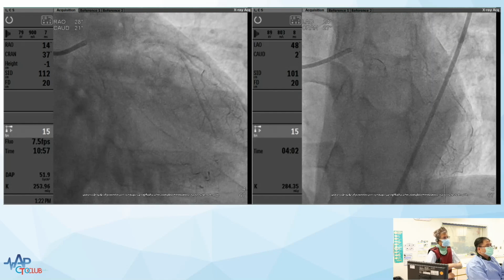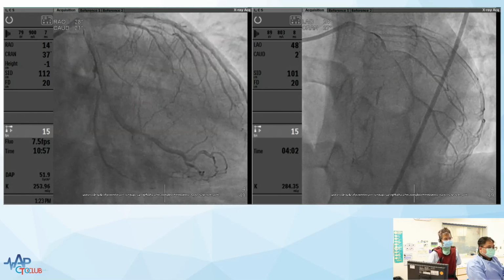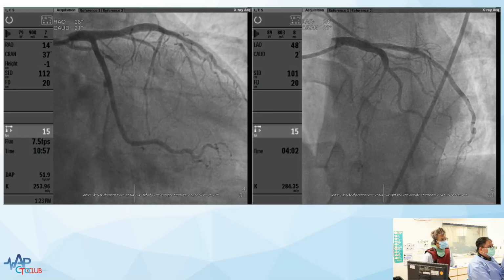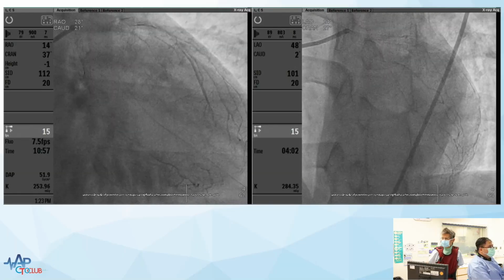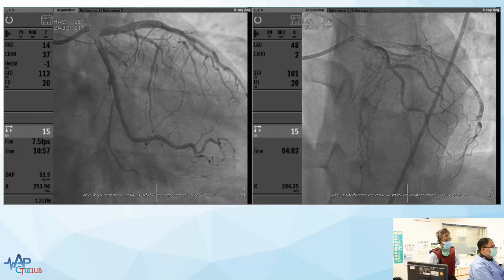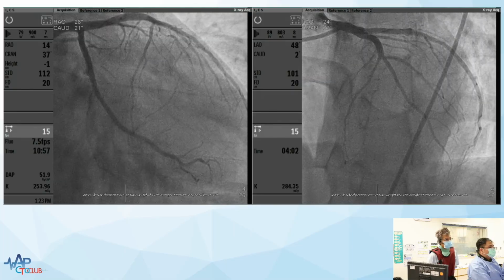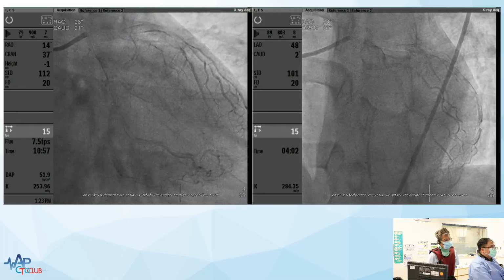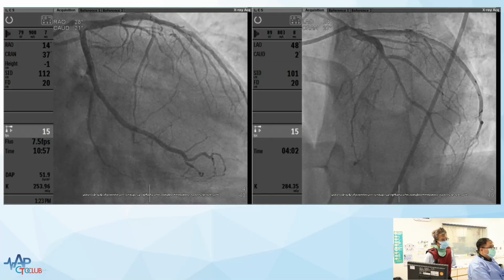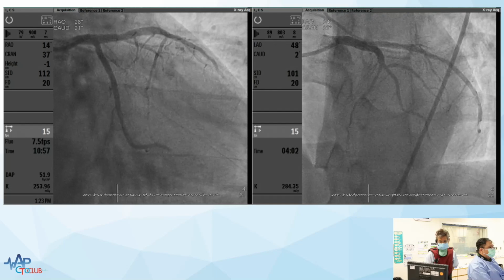Thank you. Good case. This case has a blunt CTO proximal cap that is ambiguous. And there is a large space proximal to the CTO entry. So the antegrade puncture may be difficult in this case. So first I would check the proximal cap, and under IVUS guidance using DLC, antegrade puncture will be performed.